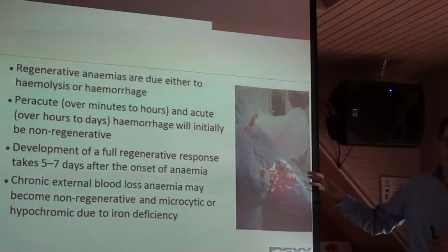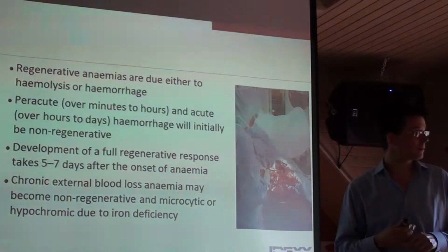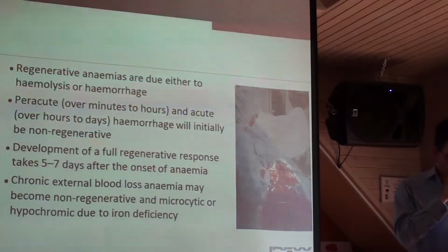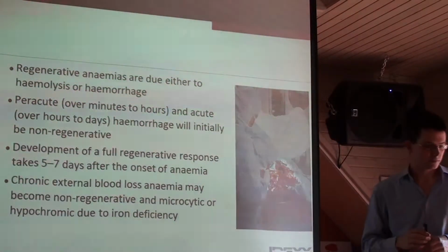However, we must think about this patient and decide, will it have a regenerative anemia today?